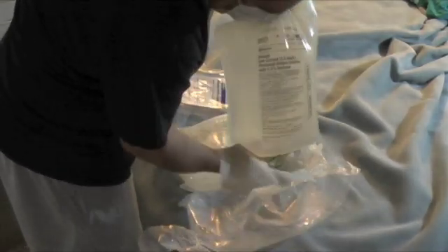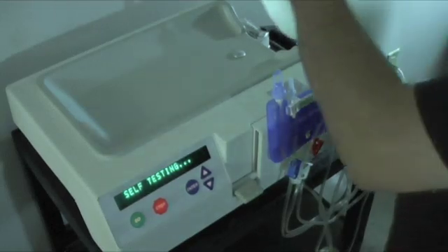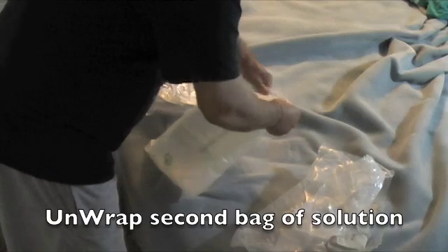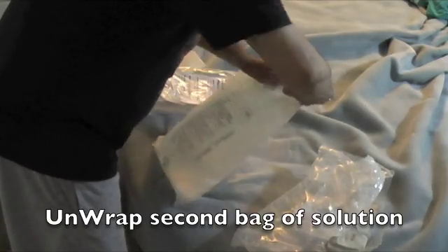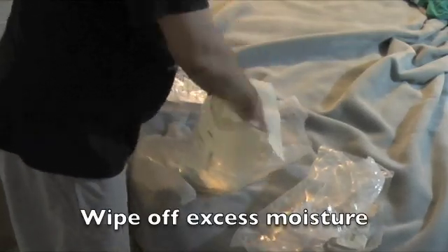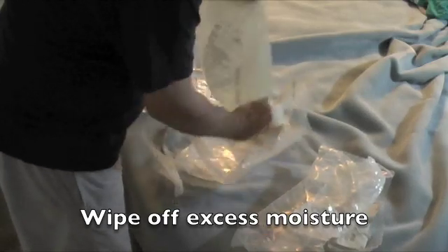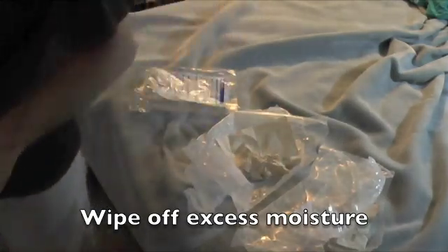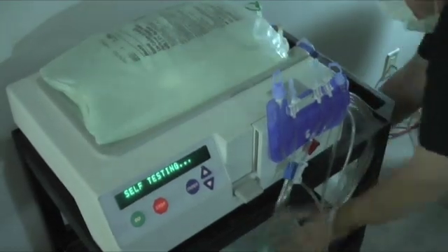I hit go to get the machine ready to test the cassette before connecting the bags of dialysis fluid. Here I'm wiping off the excess fluid on the bags since they're usually kind of moist. I place the first bag on top of the machine in the warming spot, make sure it's not leaking, and press down on it. Then I unwrap and wipe down the second bag, and place it next to — in my case, under — the machine.